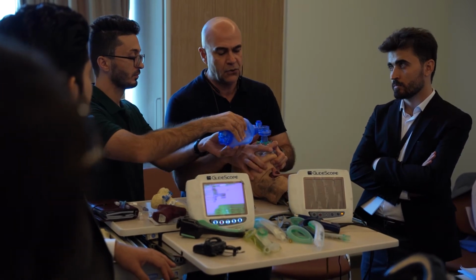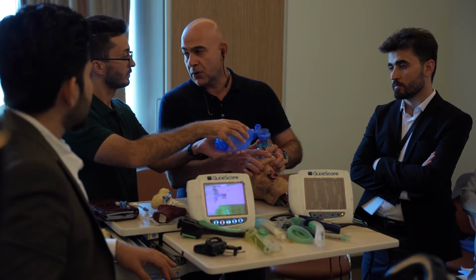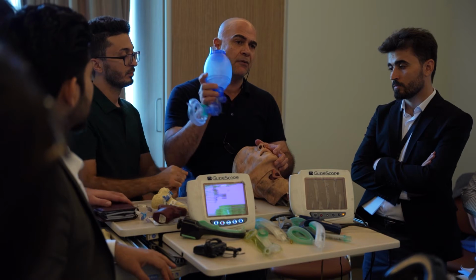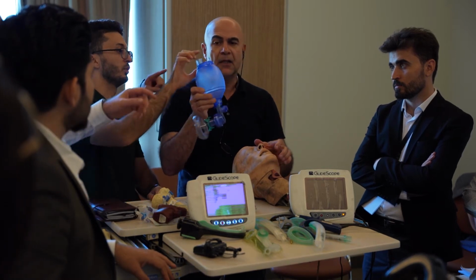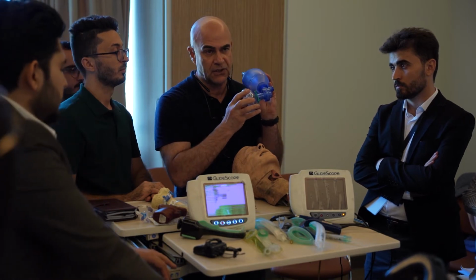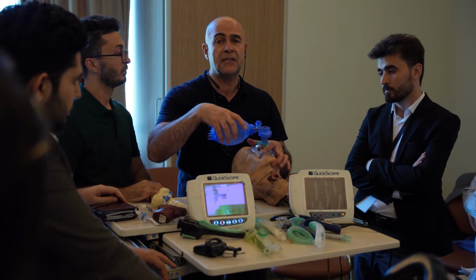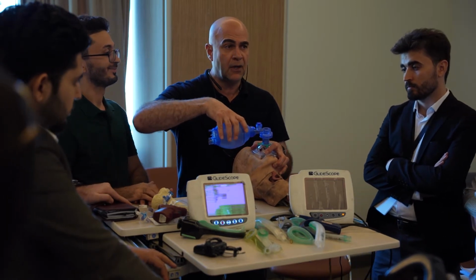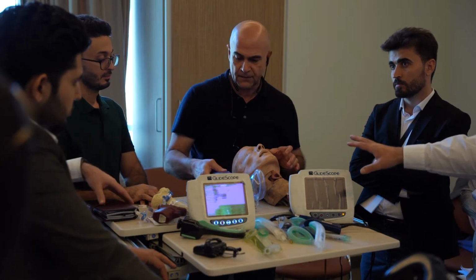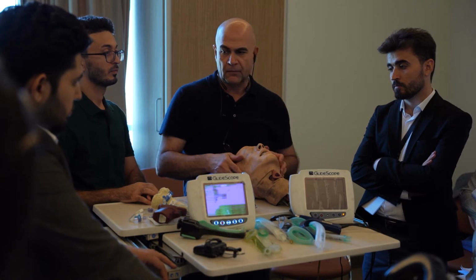You are going to use both your hands. This makes more optimization of the ventilation and oxygenation. Where do you put the probe of the oxygen? It is here. This is for inflation of the mask, not for the oxygenation. Everyone, I'm going to ask you in the examination today how you are going to do bag valve ventilation. All of you do it with Dr. Sadeek, and when you're finished, come to do intubation here.